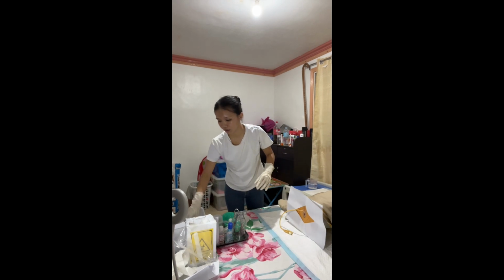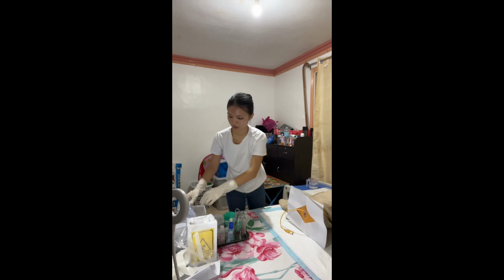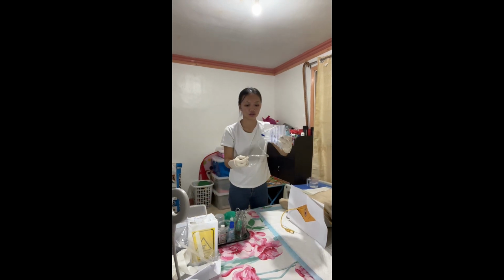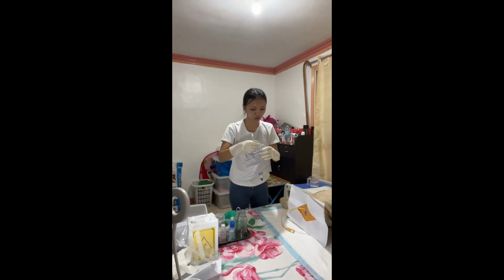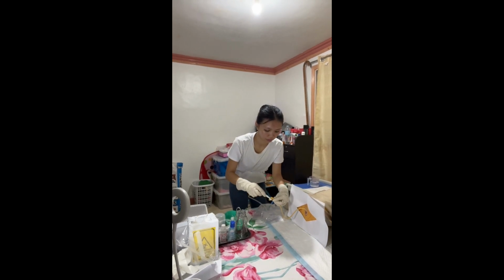Now we are going to get our urine bag. So this is our urine bag. We are going to connect this to the catheter.